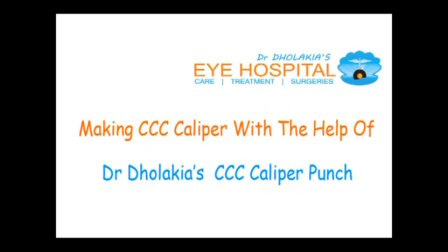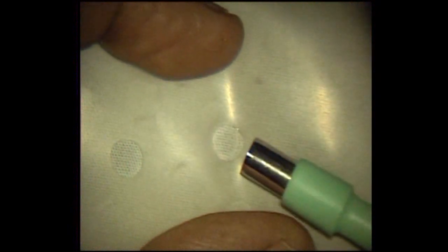Making the CCC caliper with the help of the CCC punch: spread the silicon sheet on a cloth and punch as seen in the video. You can remove the center 5 millimeter disc, which is of no use. And here is the silicon ring — your CCC caliper.